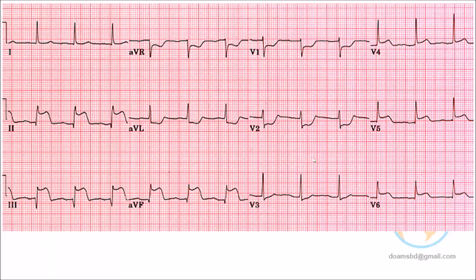Please, everybody can participate. So in the posterior wall, it will be in lead 2? No, doctor, inferior wall. It is not like a 4-wall chamber, anterior, posterior like that. Not a square chamber. Actually, 2, 3, AVF, it will be in the inferior wall. Inferior.